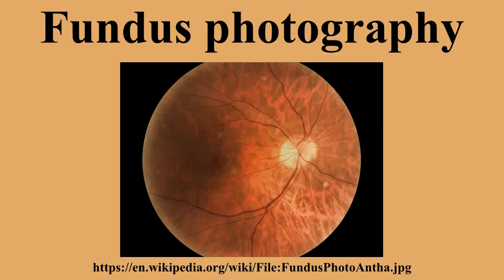the disease. It is vital for disease processes such as macular degeneration, retinal neoplasms, choroid disturbances, and diabetic retinopathy. Additionally, it aids in identifying glaucoma, multiple sclerosis, and other central nervous system abnormalities. It evaluates for irregularities in the fundus, monitors the progression of a disease, management and therapeutic outcome. They are crucial to create a starting point to better understand a disease's progression.